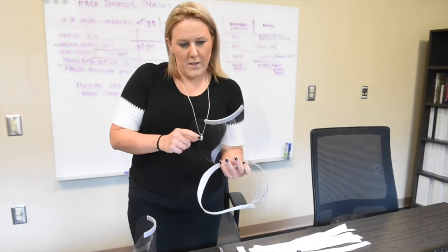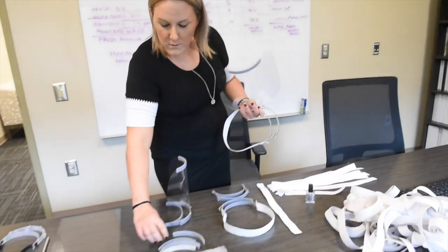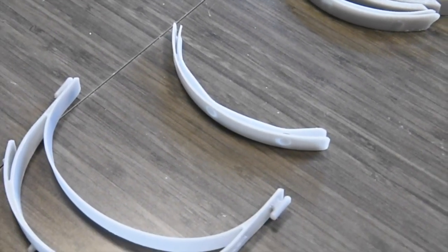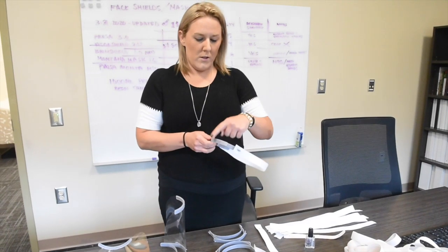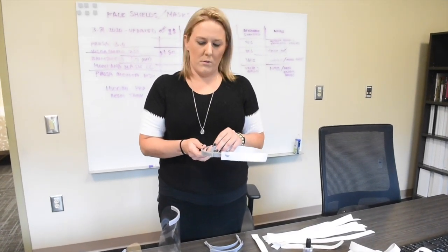Once the headband is all set up and upside down, I will apply what is called the bottom reinforcement piece. We can usually print about 20 of these at a time. With the larger and smaller versions of the Prusa printer, we print at usually around 75% and also 100% on the printing beds.